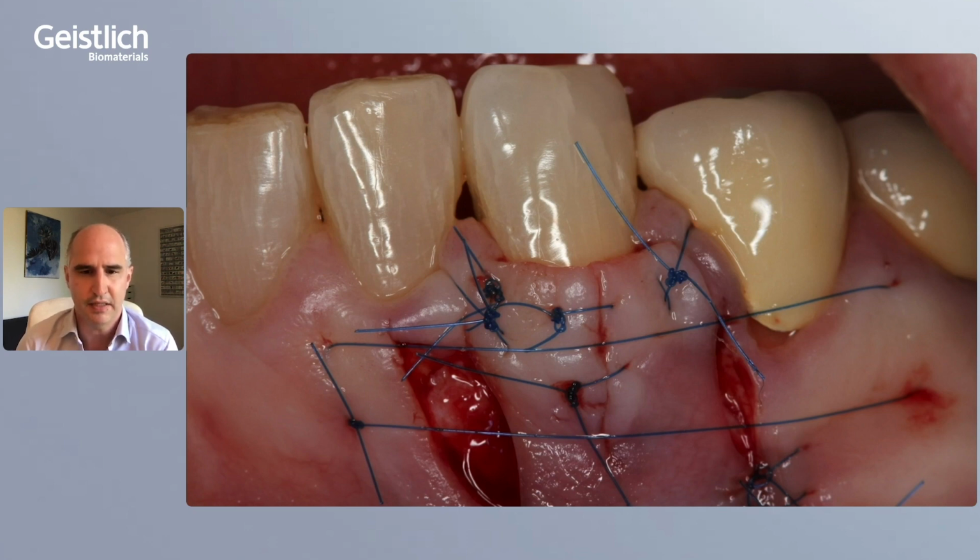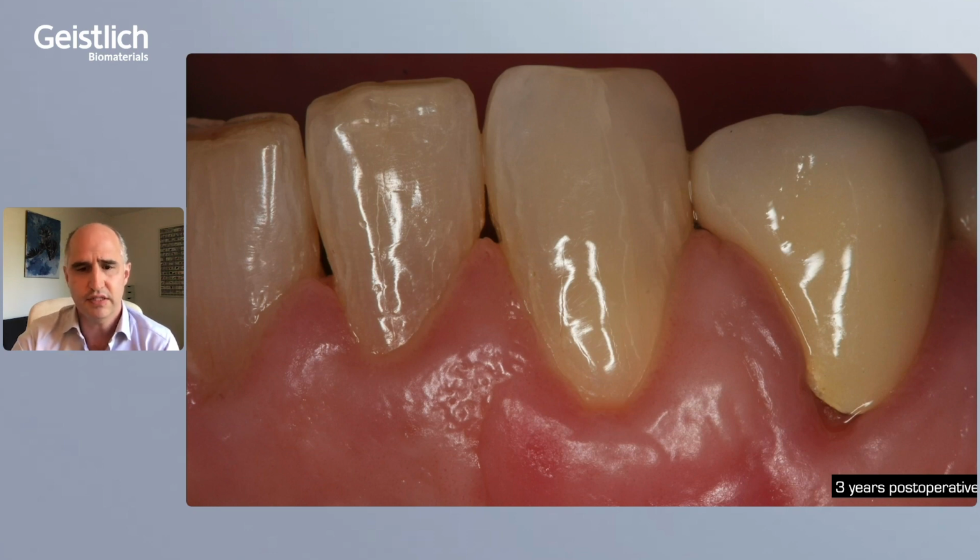You see it's a double pedicle flap, which is combined with a connective tissue graft underneath it. And you see the major aspect of it is the over contouring of the soft tissue in a more coronal position and the stabilization of the soft tissue with sutures. Now, if you look into this case 3 years down the road, you see this clinical situation. There's no inflammation, there seems to be stability over time. This is 3 years post-op and probably also over a longer time period.